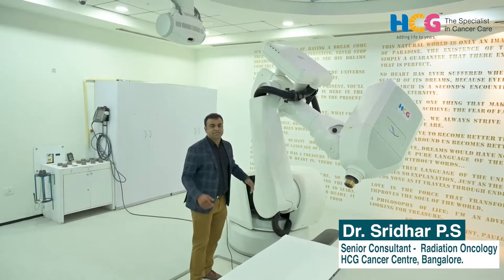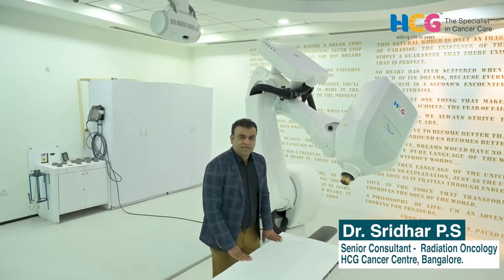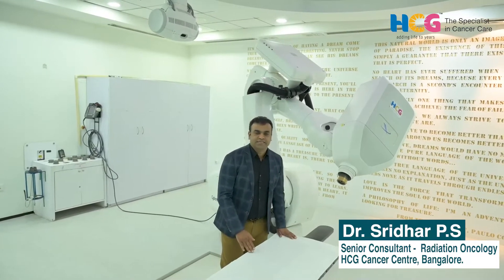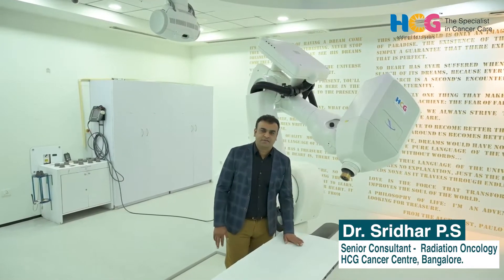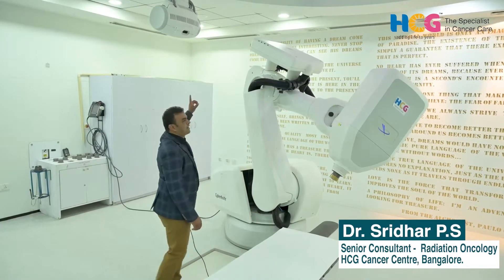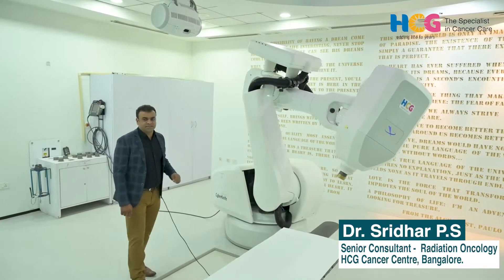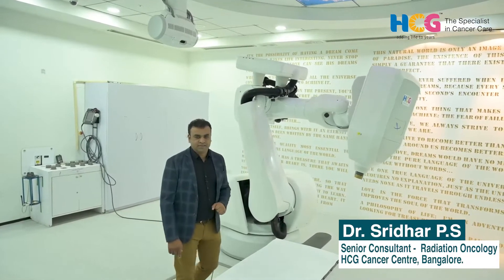The robotic arm has six axes, and the treatment table moves in six directions — X, Y, and Z. The rotational movements are also accounted for in this system. We have continuous tracking with the help of orthogonal X-rays mounted at 90 degrees.